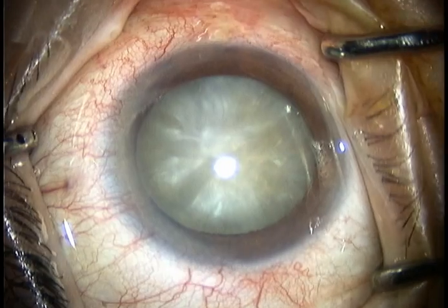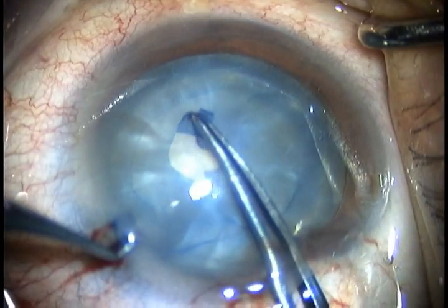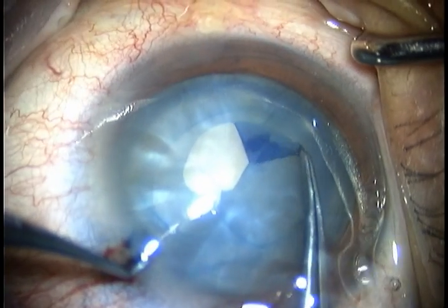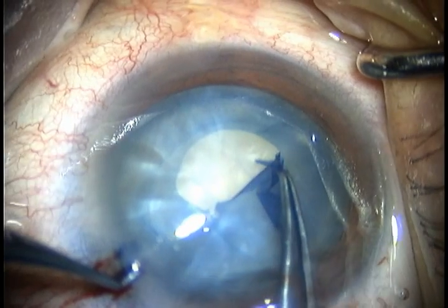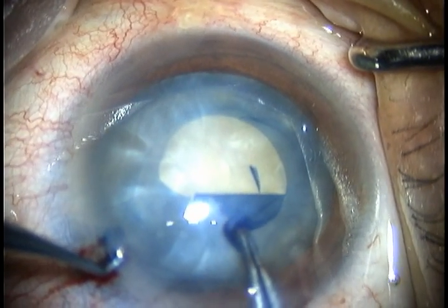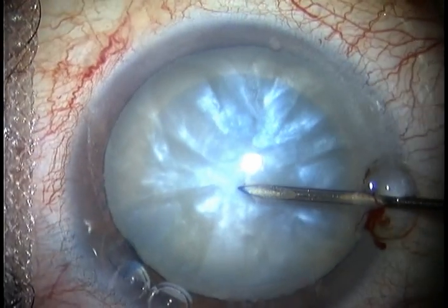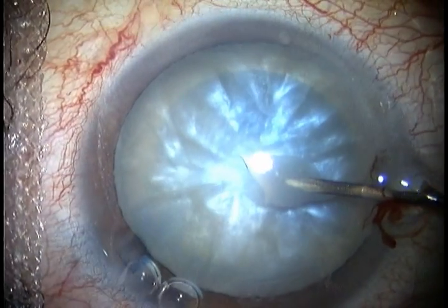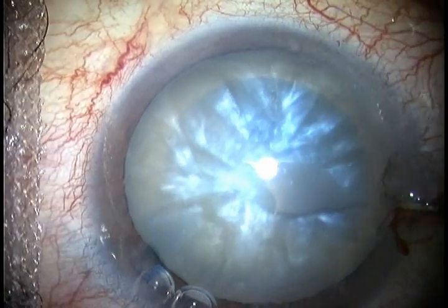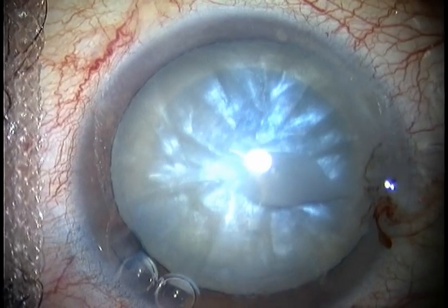Now pay close attention to these pearl-like white cataracts. When they do not have any liquid, such as this one, don't be afraid — you might as well treat them like any normal cataract with medium nuclear hardness. Whenever they have some liquid, it is often in small amounts, and that is exactly where we can be surprised by the Argentine flag sign. All of my flags appeared in this kind of cataract.